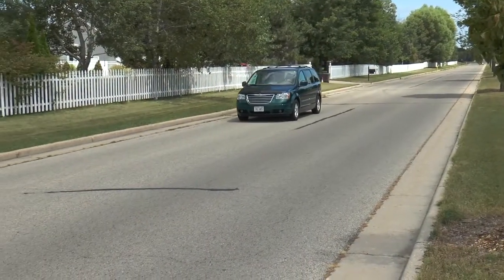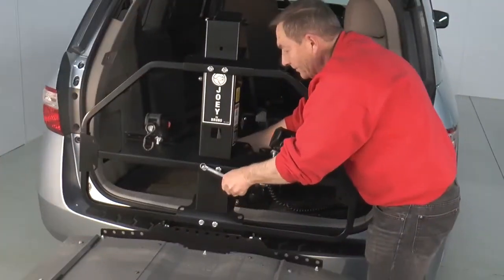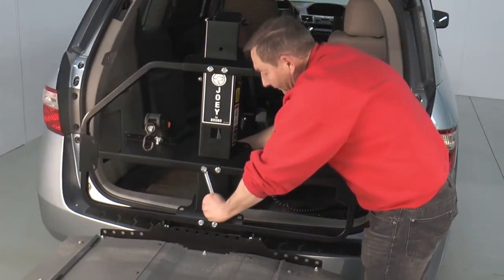The compact Joey allows second-row seating to be retained in most vehicles, so you can take your mobility device and passengers with you to your destination.